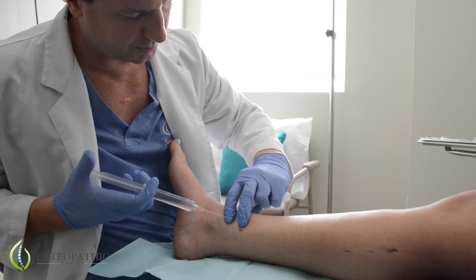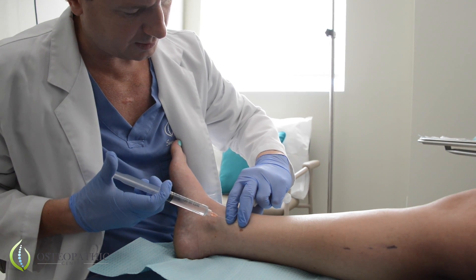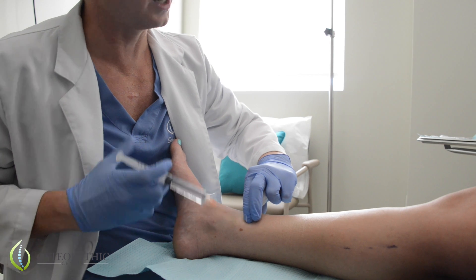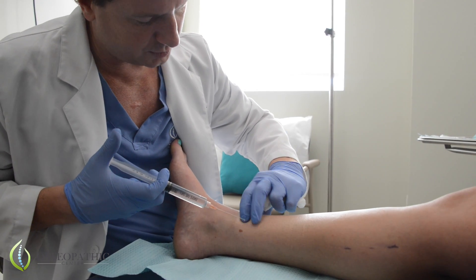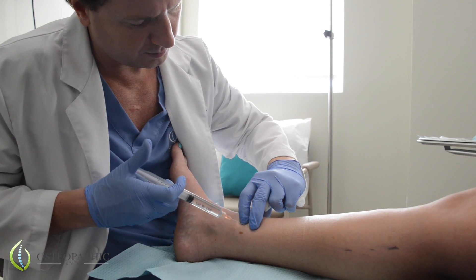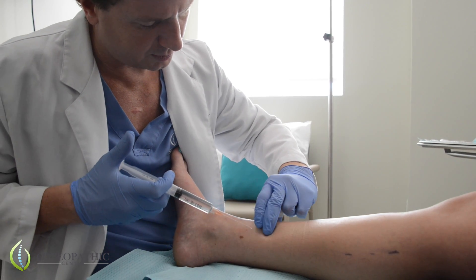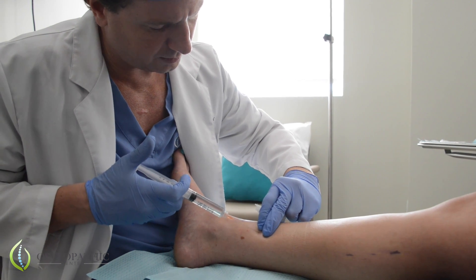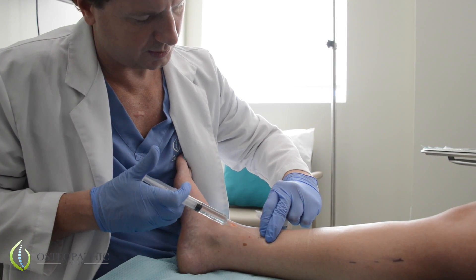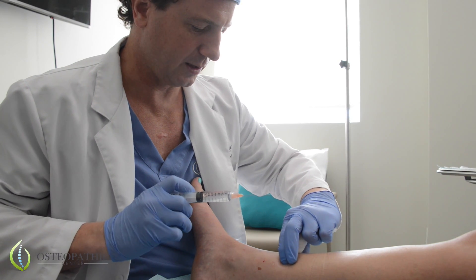Performing the injection — one, two, three. Just hold on. It's working. Hang in there. Moving to the next one — you let me know if you need a break. Here we go, on three. These are tendon attachments and the syndesmosis, which is where connective tissue comes together between the tibia and the fibula.